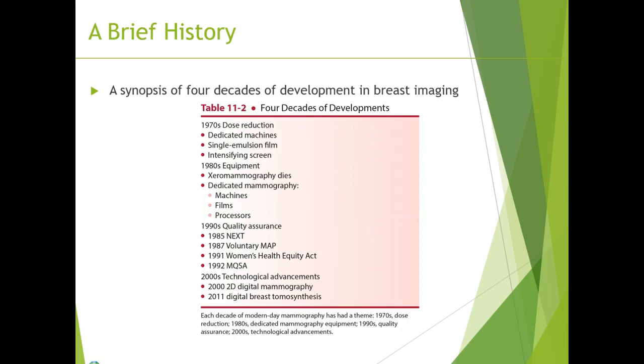The 1990s introduced quality assurance to improve and standardize quality across mammography centers and set expectations for mammography centers to be able to provide.